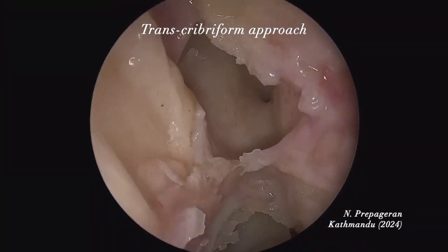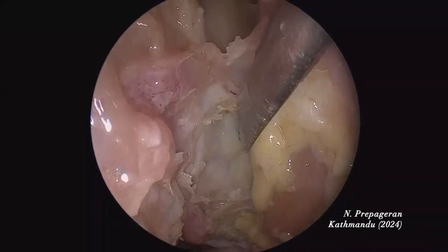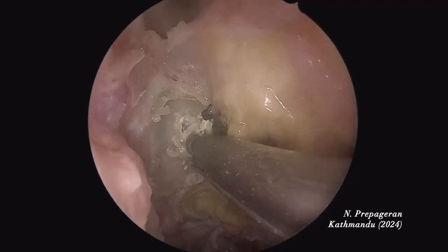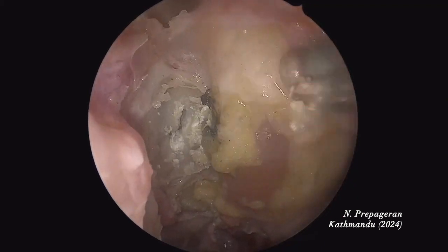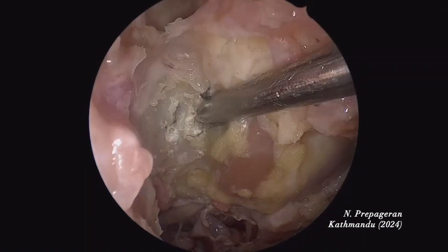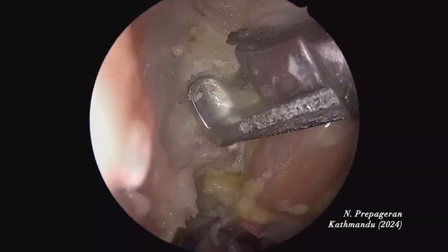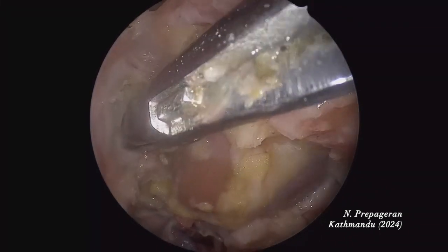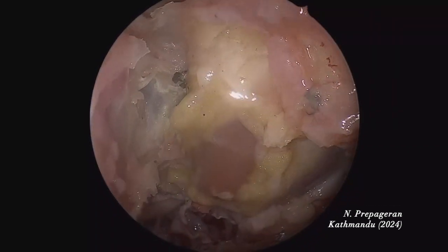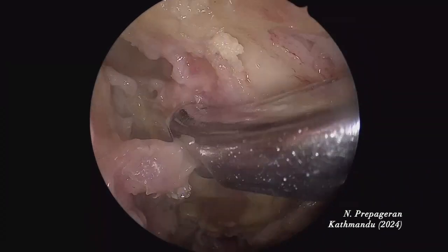Now we do the transcribriform approach. The anterior ethmoid artery and the posterior ethmoid artery — and the planum here. Use a drill to make a little opening to expose the dura. All I want is to expose the dura. So between the anterior ethmoid and posterior ethmoid arteries — you want to leave a little bit of bone to the side so that you can reconstruct. The head should be extended. I've just cauterized the anterior ethmoid artery. Now I'm going anteriorly.